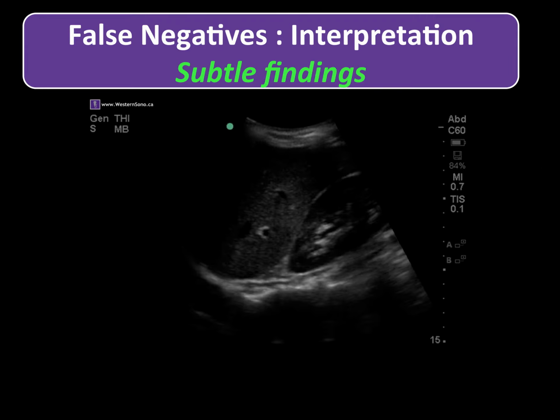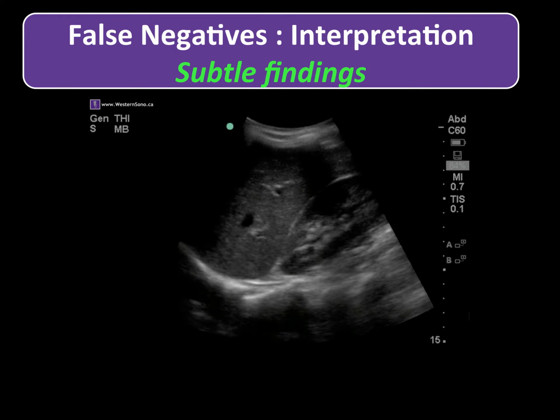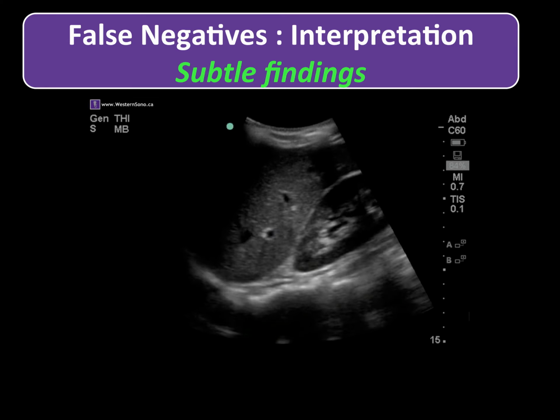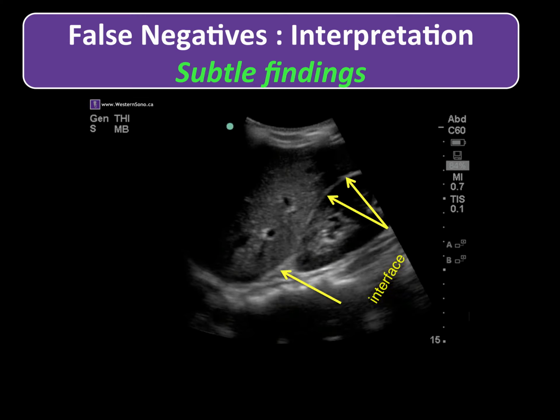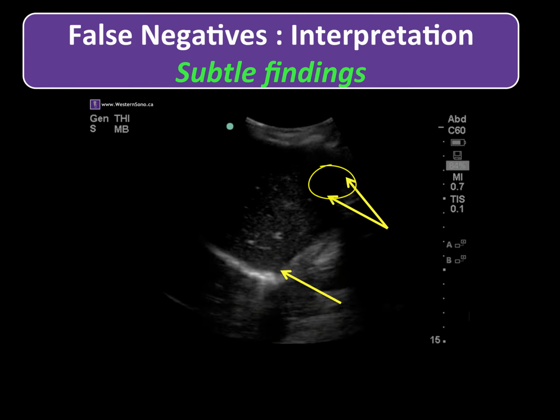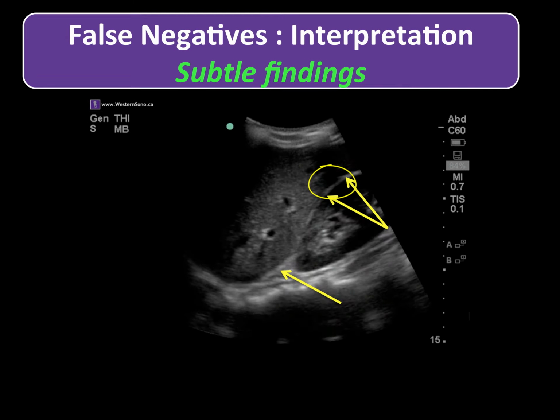Very subtle bleeding may be missed if one is not diligent in performing the FAST exam in a methodical manner. It bears repeating that once the area of interest is identified, your hand is planted and a very slow sweep performed, looking carefully for what may only be a small amount of free fluid. Let's watch again. You can see in the above clip, a quick sweep may have led to a miss in this very subtle, positive study.